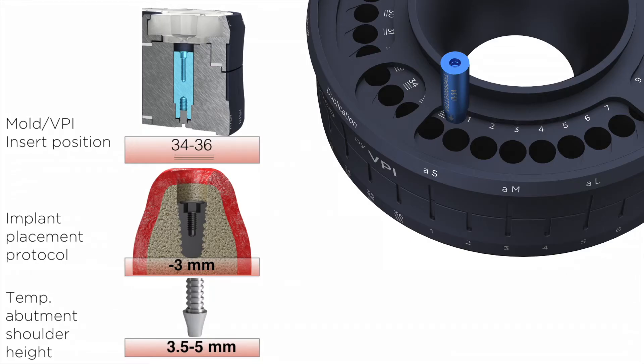Sockets 34 to 36 will receive the VPI prosthetic connection insert being three millimeters sunk into the socket. This is useful if your implant placement protocol involves three millimeter sub-crestal placement.